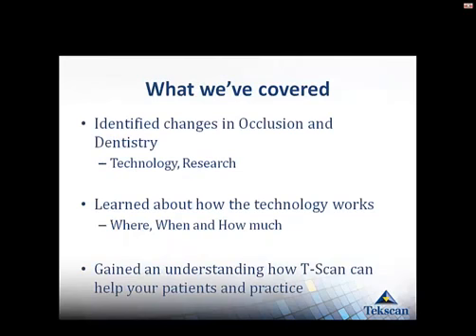So what we've covered today is we've been able to identify some of the changes in occlusion and in dentistry through technology and research. We've learned how the technology works. We learned to focus on where, when, and how much, and how TScan can put your paper marks into context. And hopefully you've gained an understanding of how TScan can really help your patients and your practice.